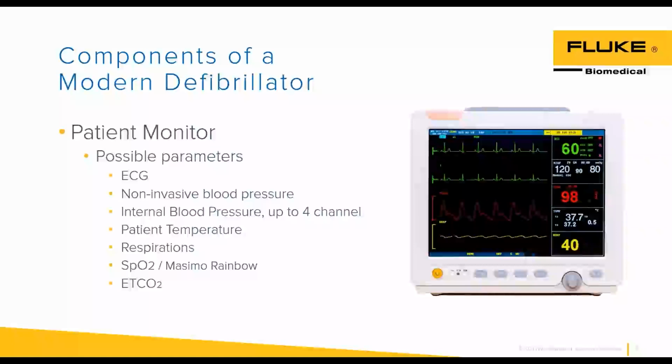So it's something to consider, because not all patient simulators out there can actually catch that ascending NIBP versus the descending. Now, remember, when we're checking NIBP, we're going to do that at a static pressure, right? We're not going to check it on the dynamic pressure. It's going to be a static check. But we always want to run one or two simulations just to make sure it's going to catch. So if your simulator can't do that, a lot of these defibrillators that have the ascending NIBP can flip over and also read descending. So just something really to note.